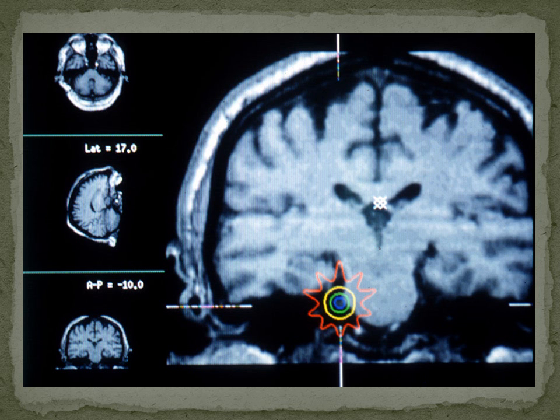When you think about radiosurgery, people always ask, how accurate do you really need to be? And the answer really is you need to be as accurate on every procedure as on any procedure. So if you're going to do trigeminal neuralgia, delivering 90 hundred centigray to the center of the trigeminal nerve, you had better be accurate within a fraction of a millimeter. And once you do that, it commits you to that type of accuracy throughout all of your procedures.